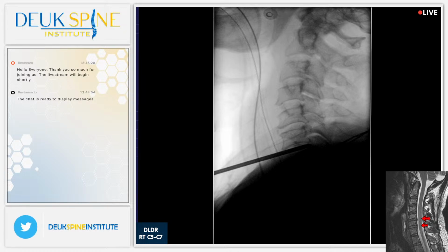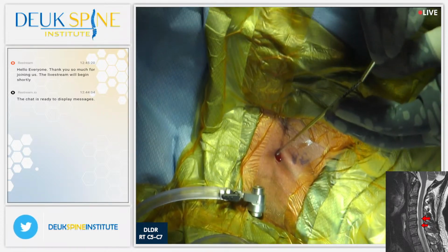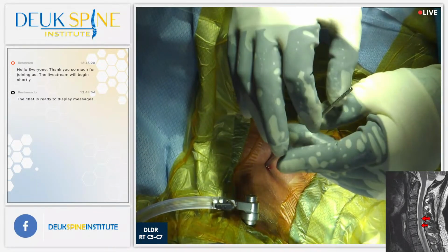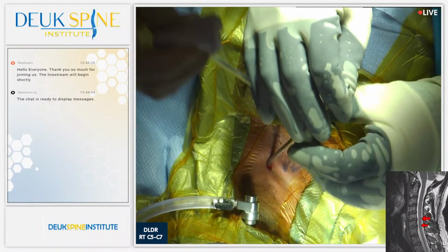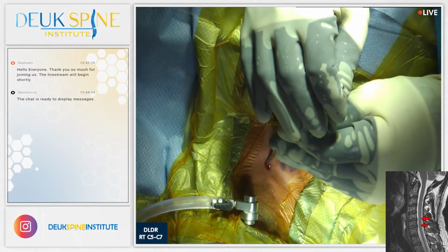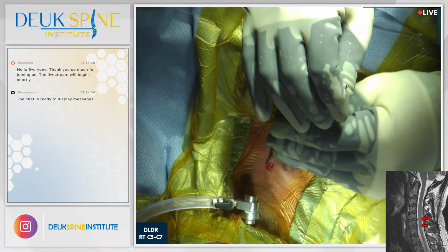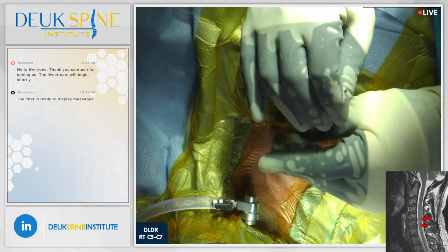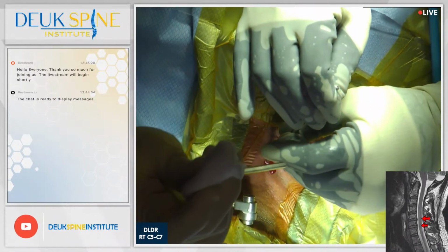Next, we're going to bring this tube. It's a 4mm tube, outer diameter. The whole surgery is done through this tiny metal straw. This is called a tubular retractor. It's a retractor because it retracts the tissues away so the surgeon can do surgery, but it's also in the shape of a tube, therefore tubular. It's a type of retractor used in endoscopic surgery.